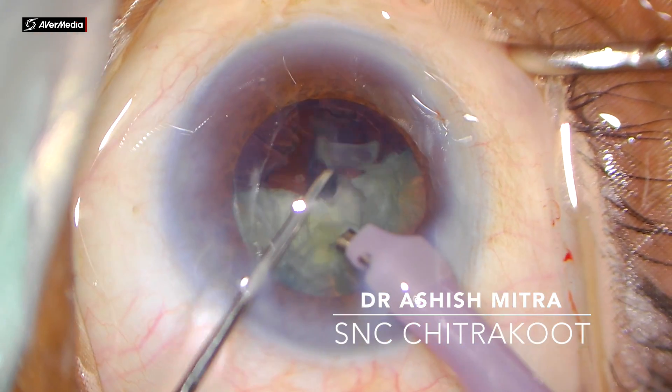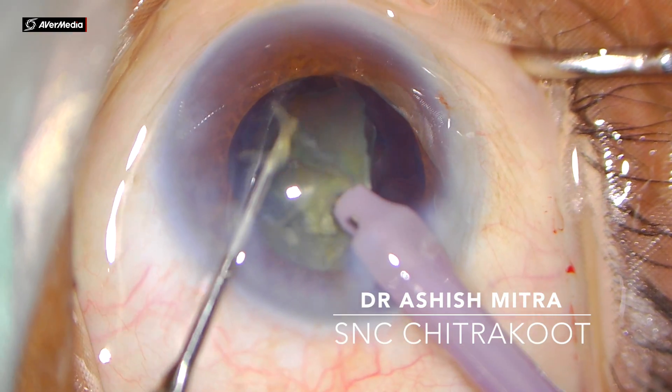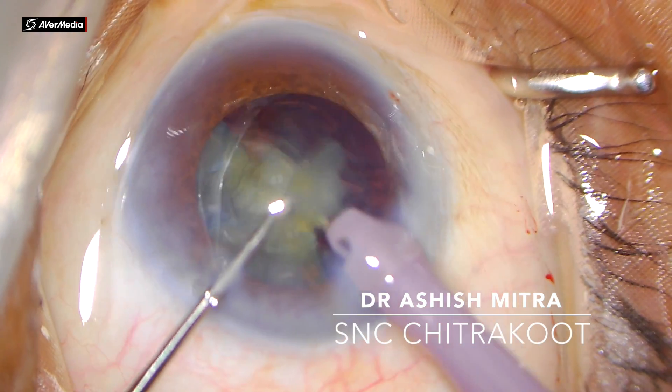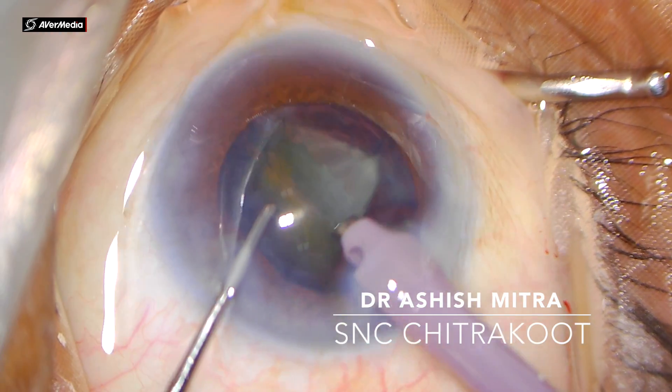At times you use the chopper when dealing with hard cataracts — even though you crack into small pieces, they are sometimes hard to emulsify. Once you bring them into the central safe zone, you may require to break those small pieces again into much smaller pieces with the help of the chopper.